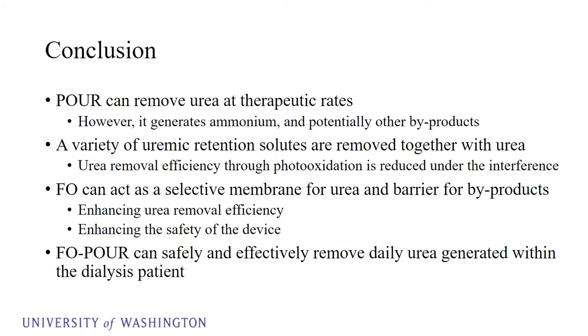So here's the conclusion. First, the POR units can remove urea at therapeutic rates. That's around 15 grams of urea in a day. However, while it's removing urea, it will generate ammonium and potentially other byproducts.